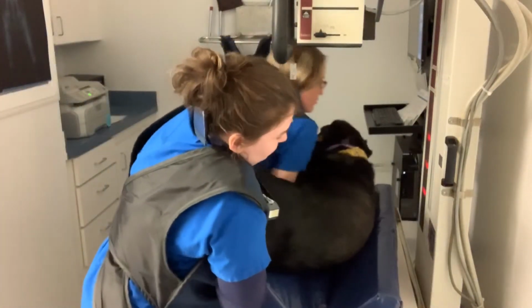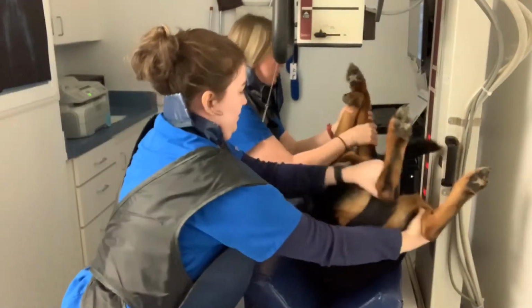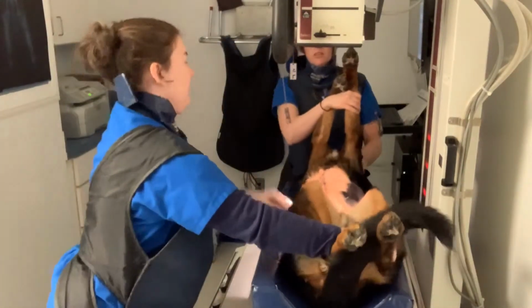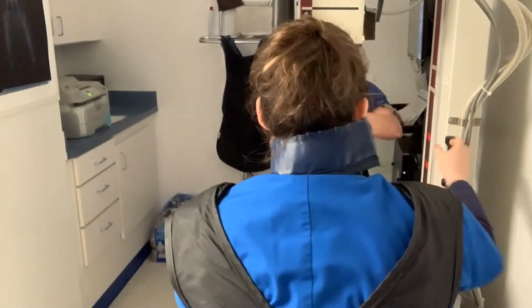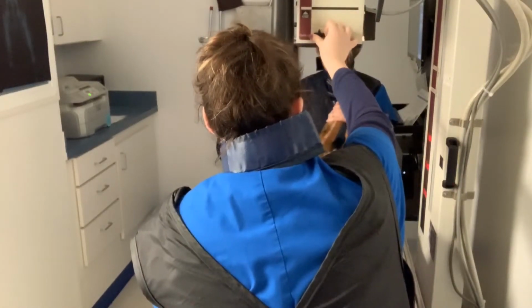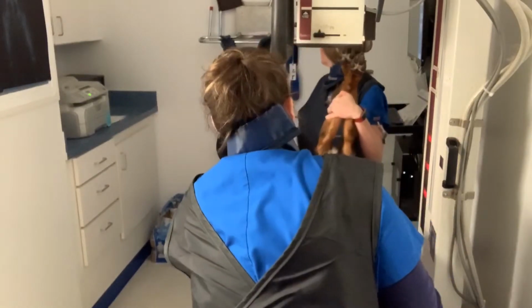To prep the patient, the area being radiographed should not have any radiodense artifacts, including food, bowel contents, and gas, that could be misdiagnosed as lesions and abnormalities. If the animal is not anorectic or vomiting, fast at least 12 hours prior to administration of the contrast meal. Fasting for 24 hours is best if mucosal disease of the small intestine is being evaluated.